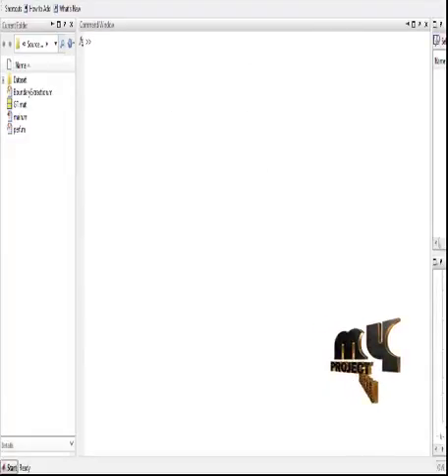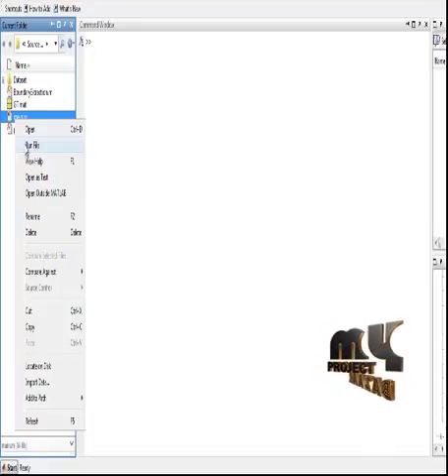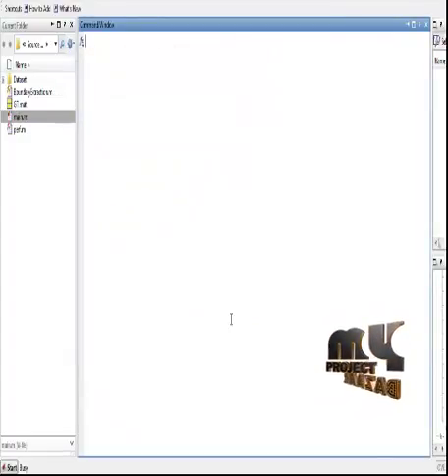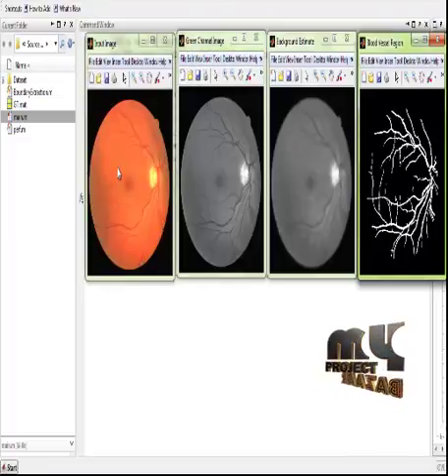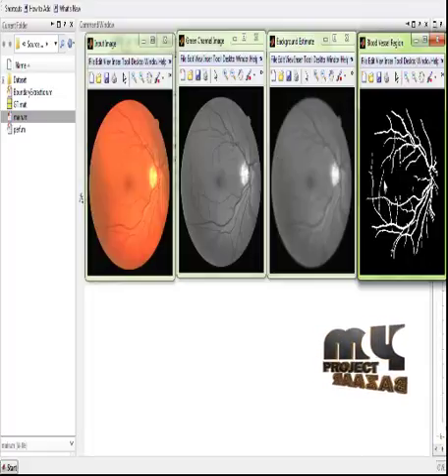Let us see the running procedure of the process. To run the code, select the file main.m which is located in the source code folder. Right click it and click on run file. The process will start. Select any one of the images present in the dataset. The process will now be executed and all the results will be displayed. This is the input image selected, this is the green channel of the input image, and then the background regions are estimated from the input image.